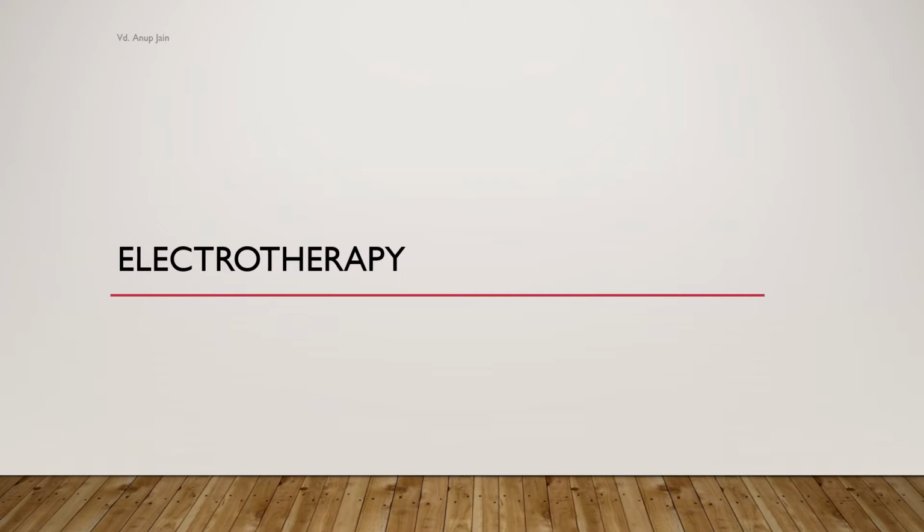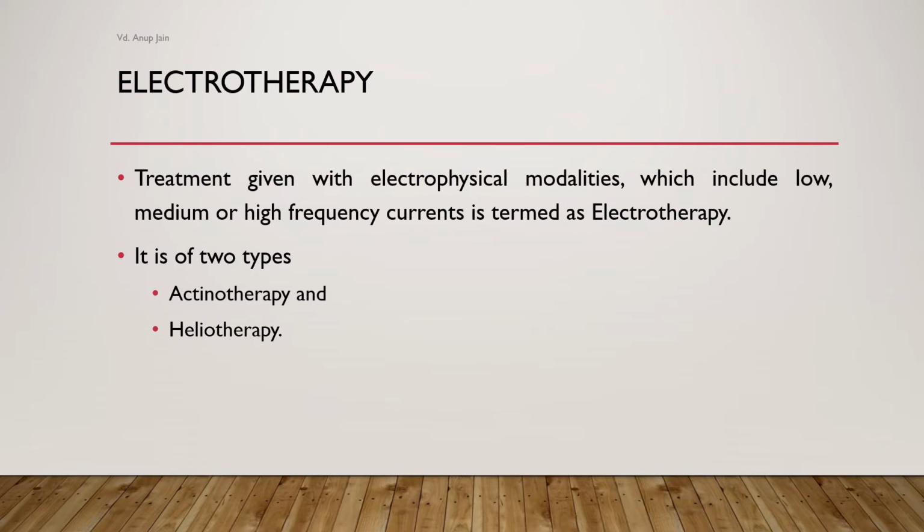First we will study electrotherapy, in which electrical current is used to give therapies. In electrotherapy, the treatment is given with the help of electrophysical modalities, which may include low, medium, or high frequency currents, and such treatments are termed as electrotherapy.